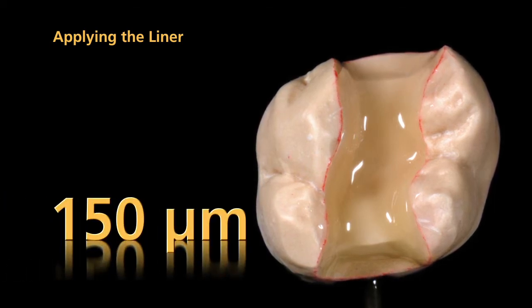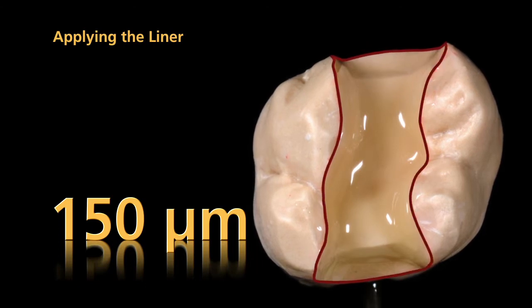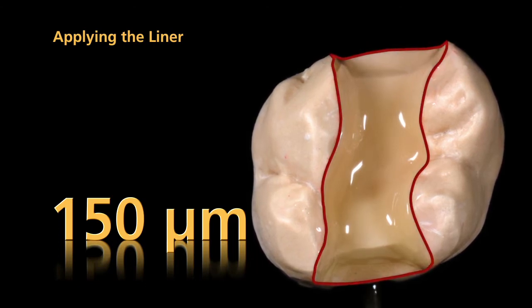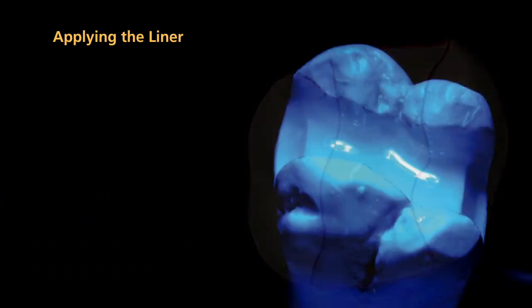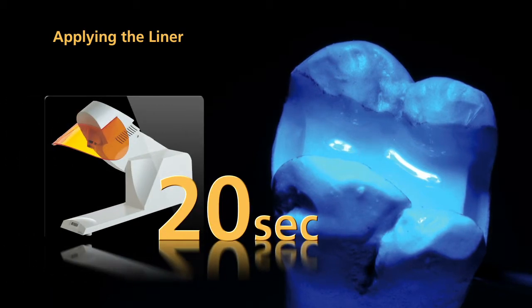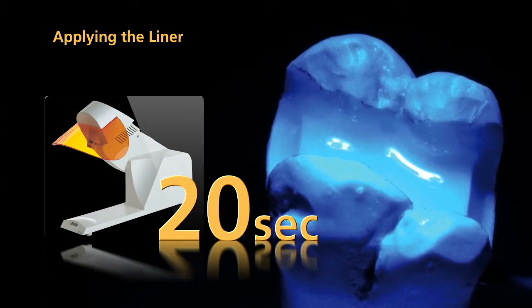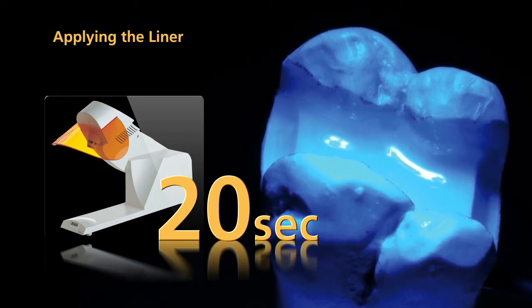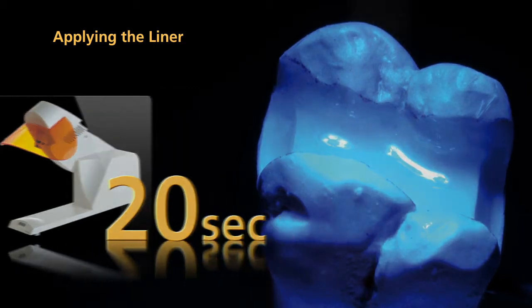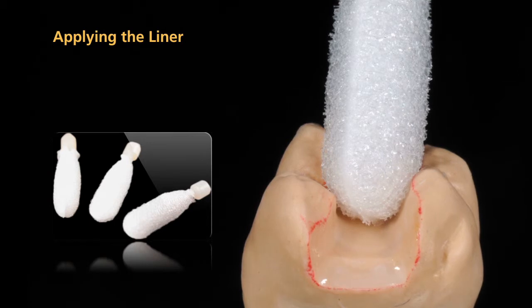It is important that you now apply the liner up to the preparation margin to ensure a reliable bond between the preparation margin and the luting composite. Finally, pre-cure each segment again for 20 seconds. Please note that polymerized SR Nexco liner should not be separated from the die. The liner is now pre-cured. Thoroughly remove the resulting inhibition layer using a disposable sponge.